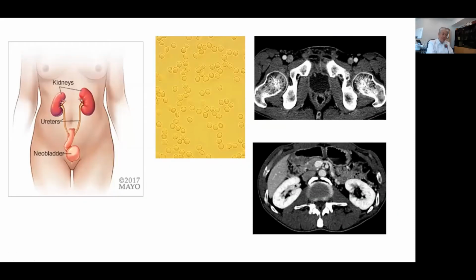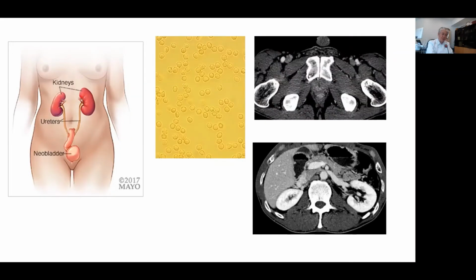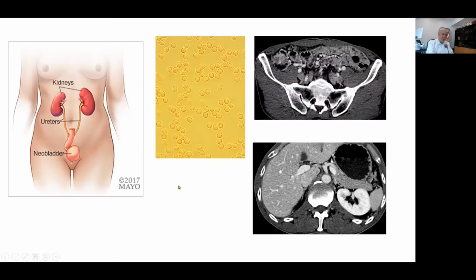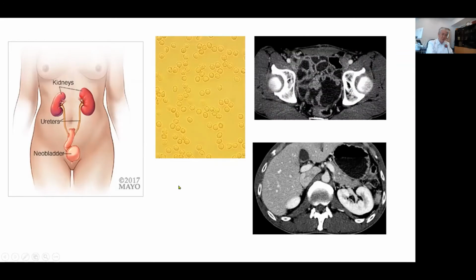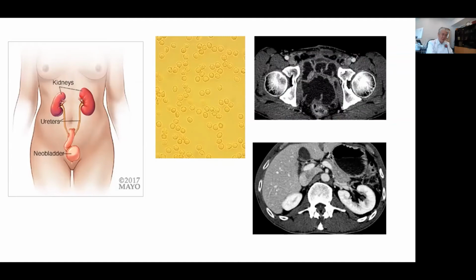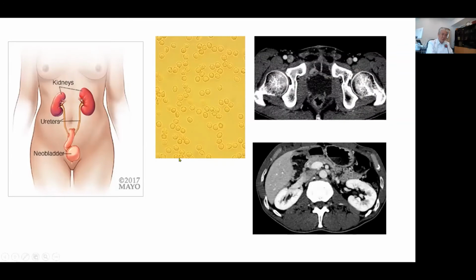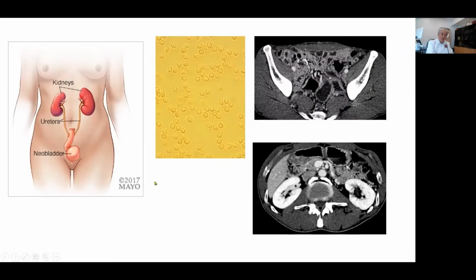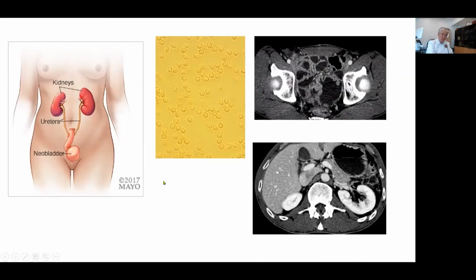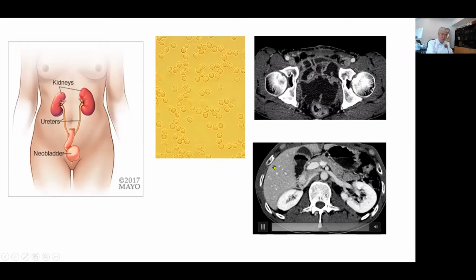Recently, we have done a study in patients with bladder cancer who underwent radical cystectomy and neobladder formation. After surgery, these patients are usually followed up with regular CT examinations and regular urine analysis. If those patients show persistent microscopic hematuria, patients and physicians, both sides, worry about the possibility of tumor recurrence, and in those cases, CT findings are very important.